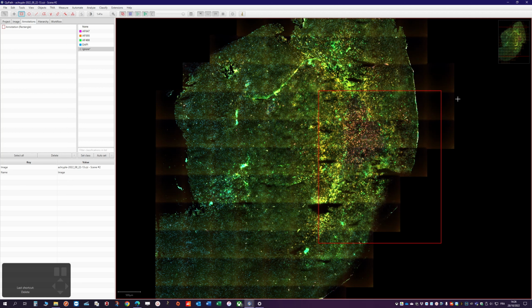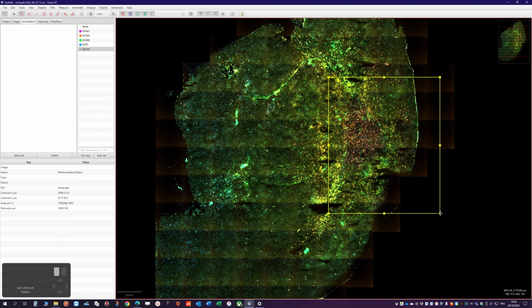Let's try again. Select this region, Alt. Okay, now it works. It's a bit capricious sometimes.